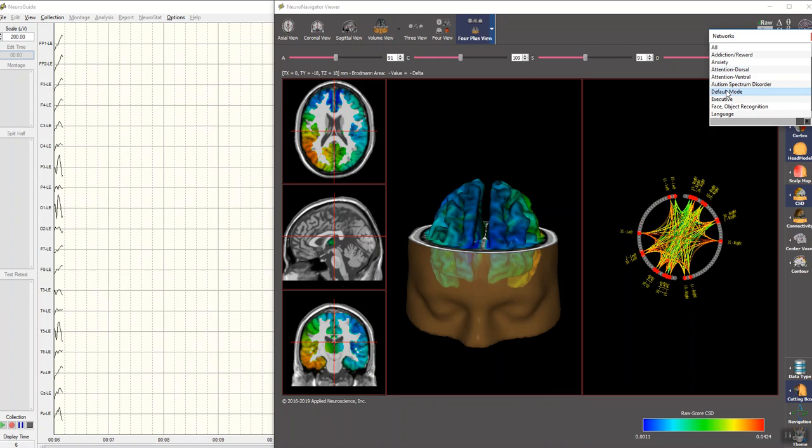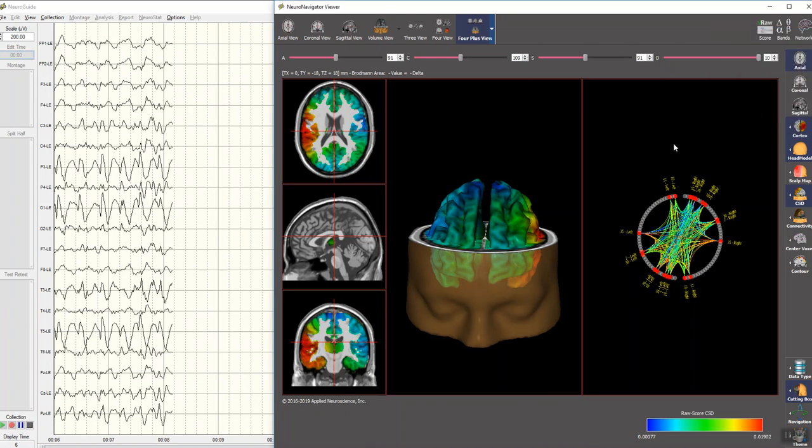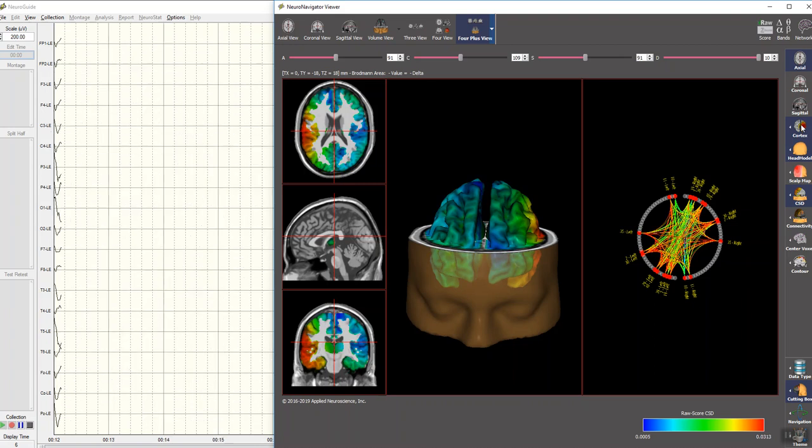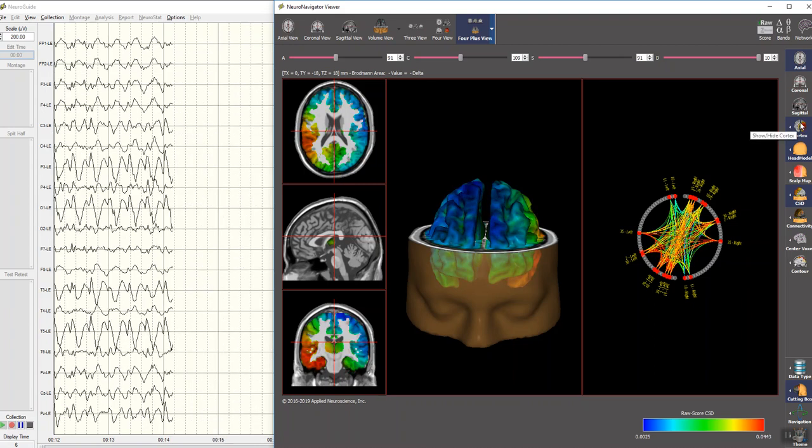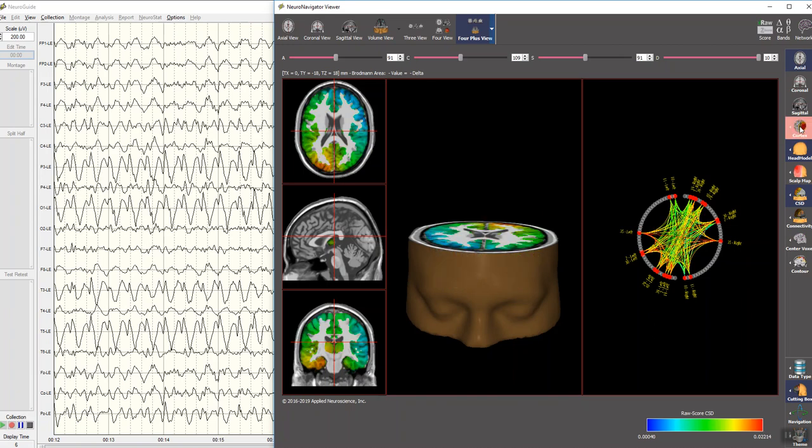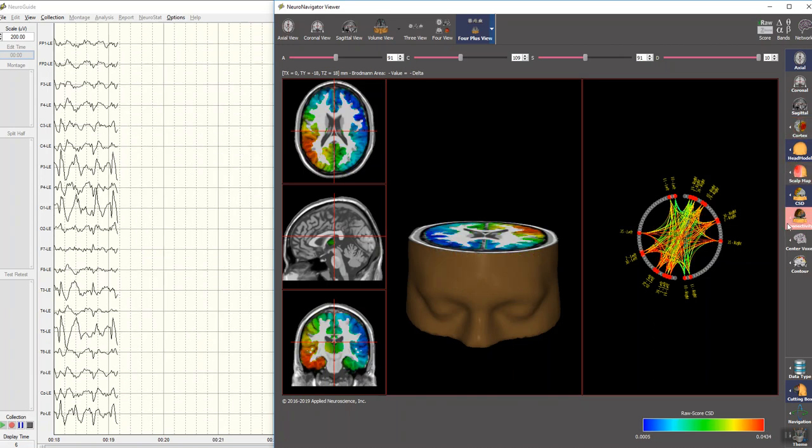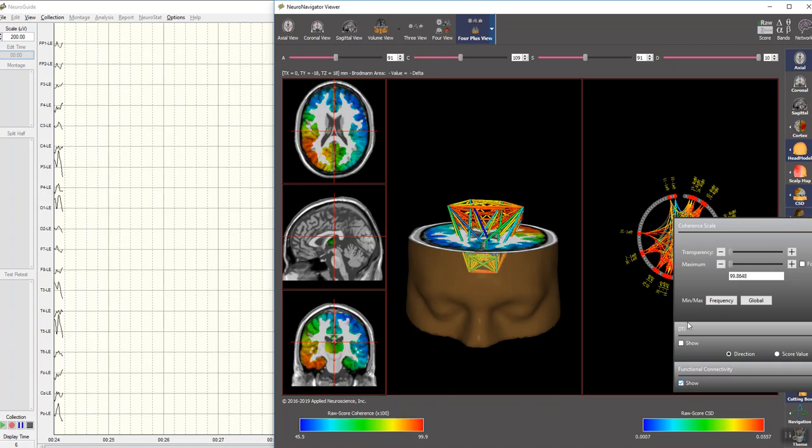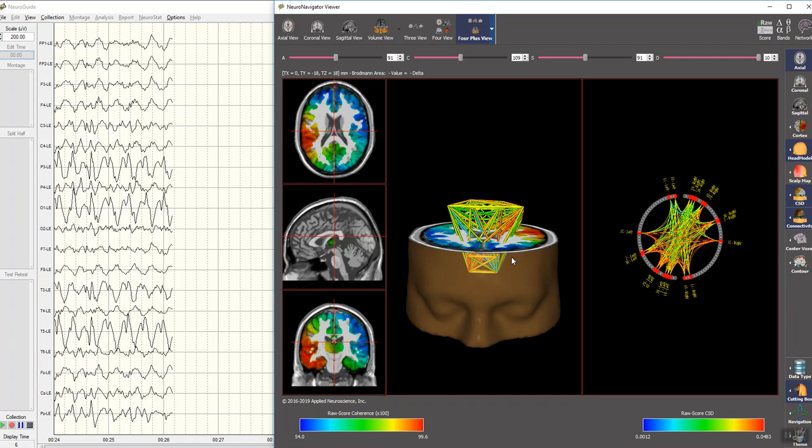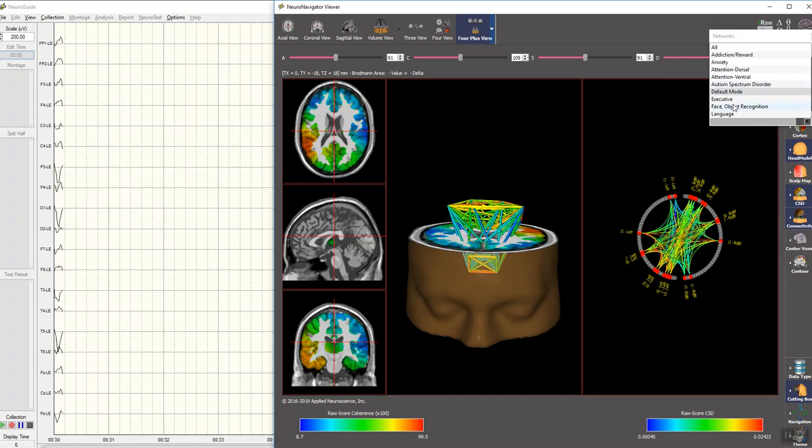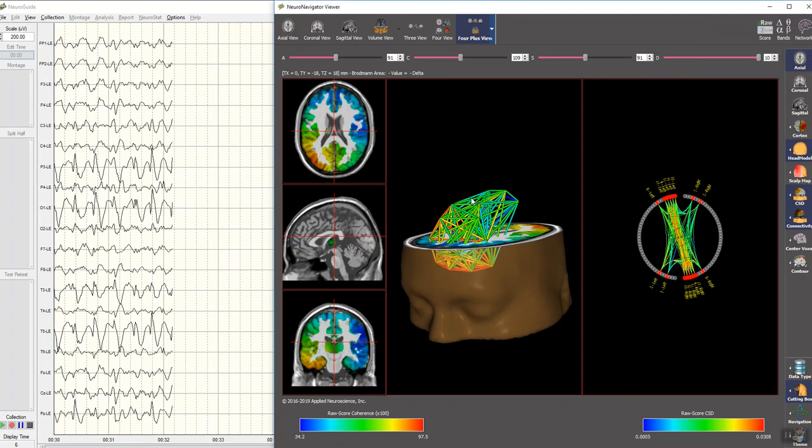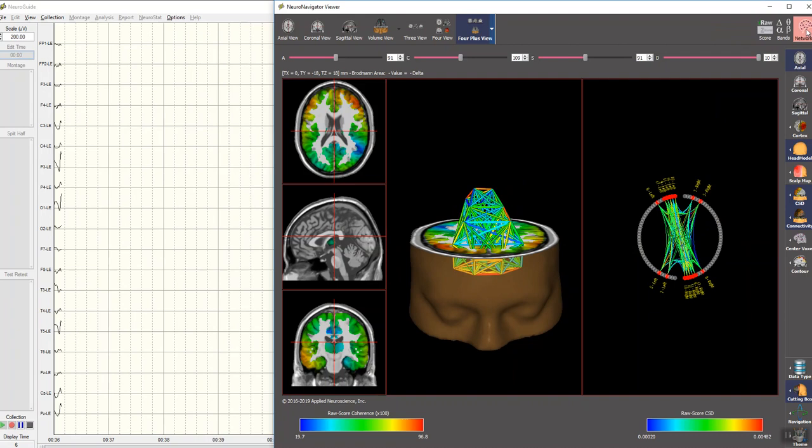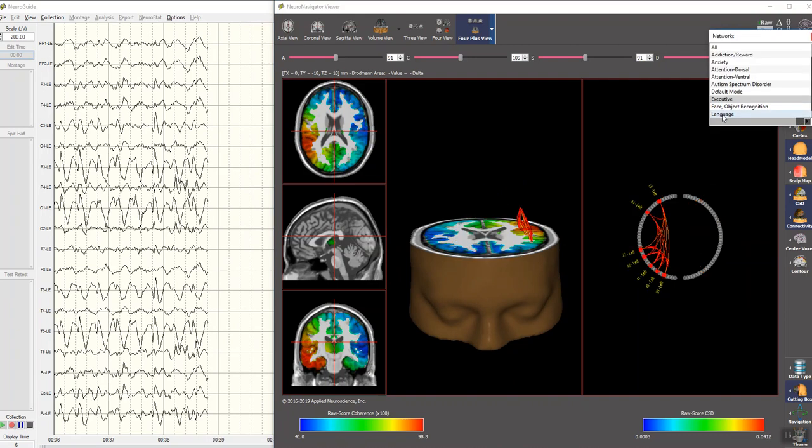Here's the default network, for example. We can also look at this network in real time between Brodmann areas in three dimensions. So we have both two dimensions and three dimensions here. I'm just going to get rid of the cortex for a minute, go to connectivity, and show functional connectivity. This is of the same network, which is the default network. Here's the executive network. Here's the language network.